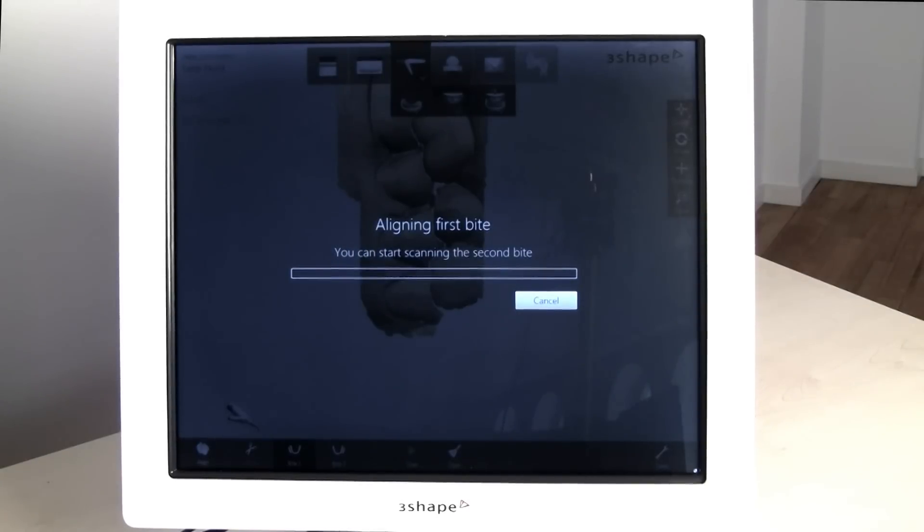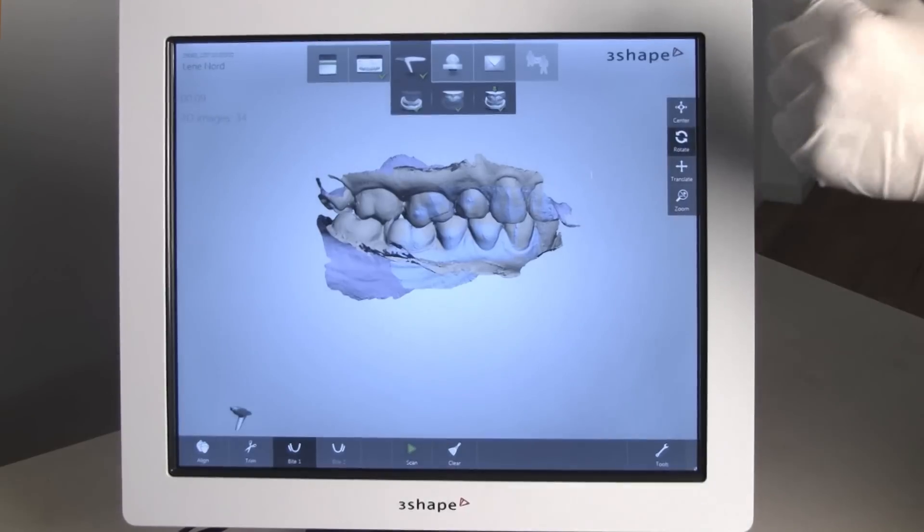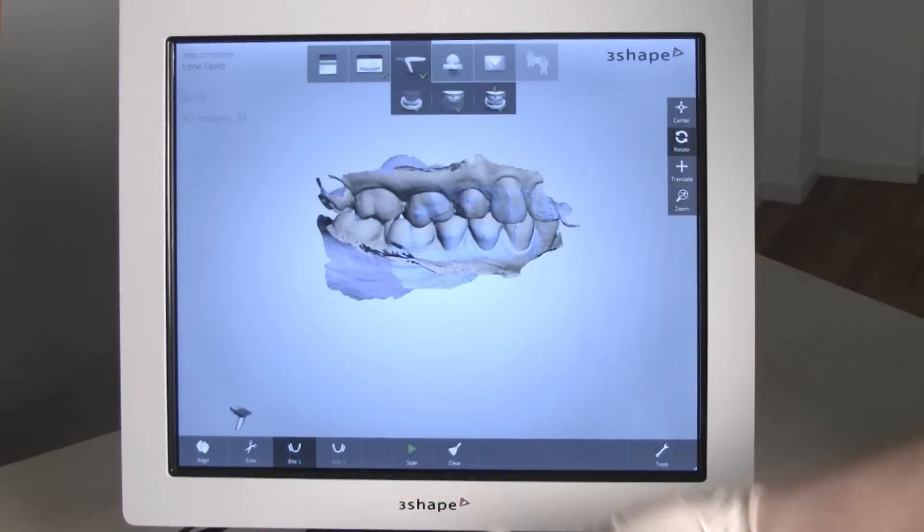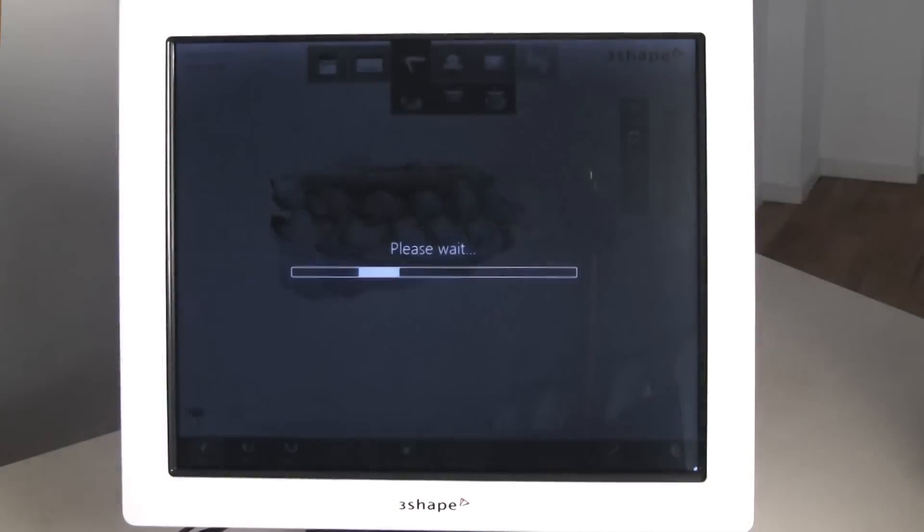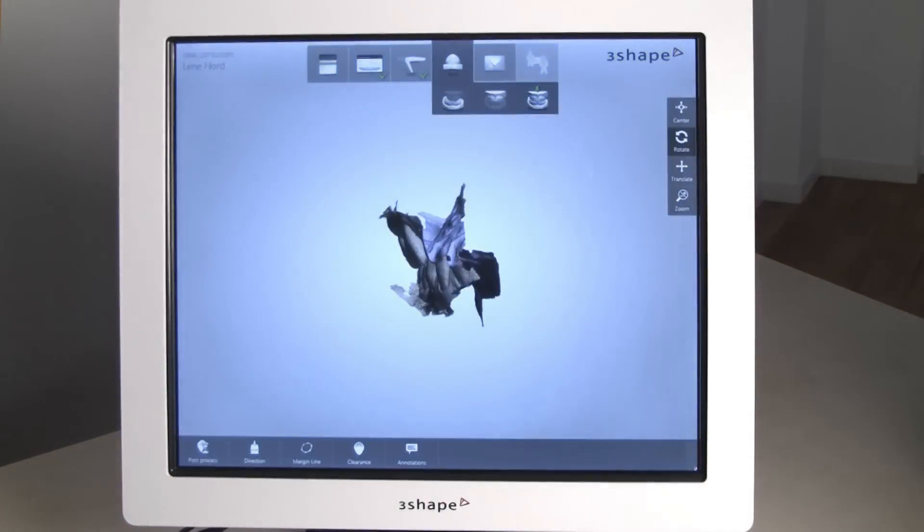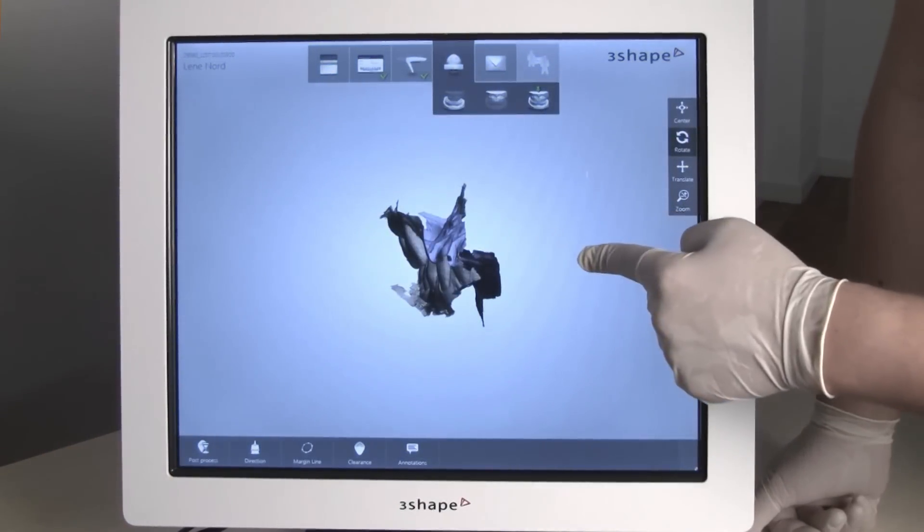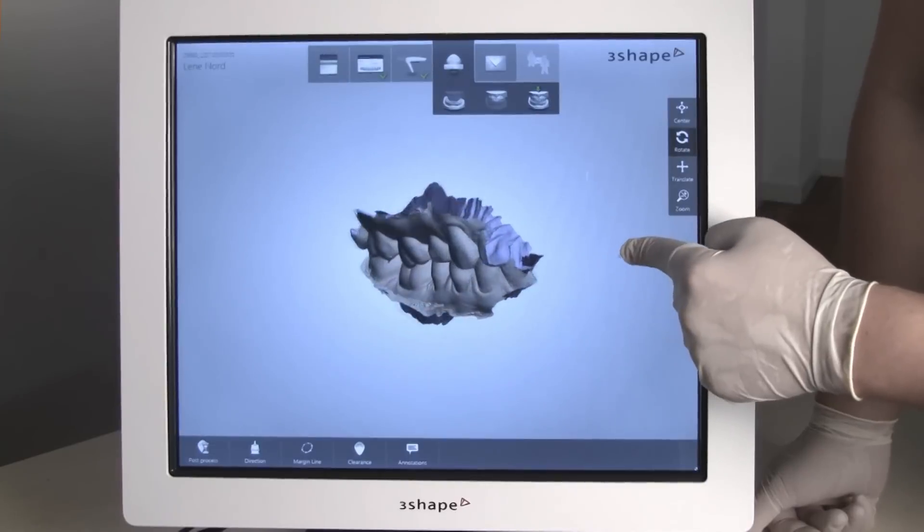If scanning a full jaw case, then two bite scans are required. The second bite scan can be initiated even though the progress bar indicates that alignment is still in progress.